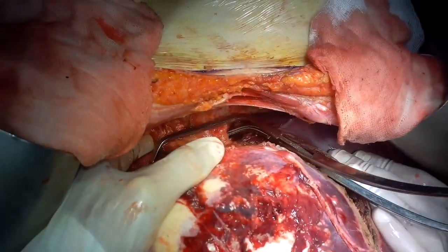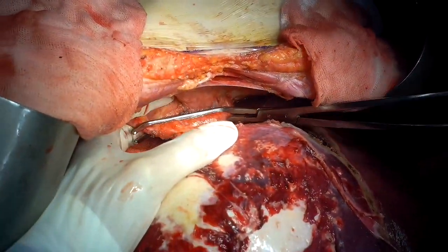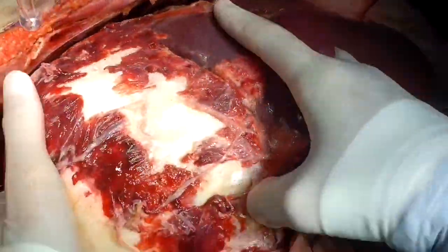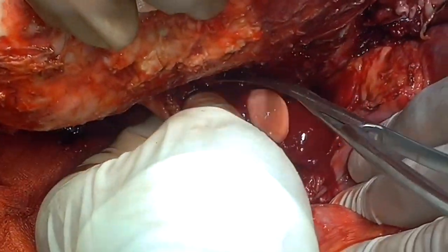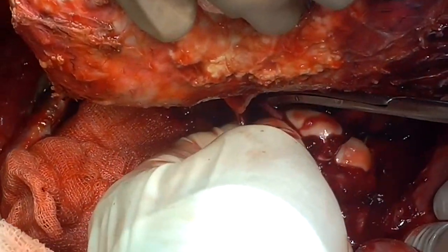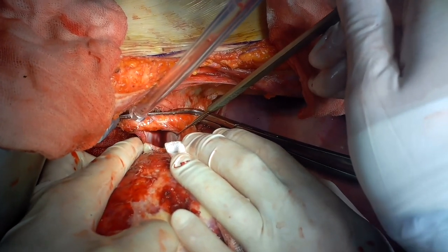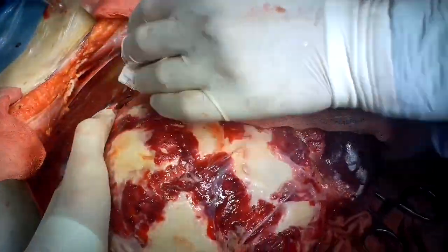Then we apply a Satinsky clamp on the IVC above the liver. Thus, the liver is under total vascular exclusion. We then cut the portal vein. Next, we transect the inferior vena cava at the infrahepatic part, and then above the liver.